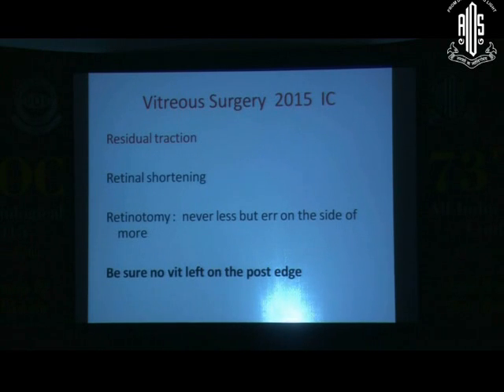However, if there is an intraretinal shortening, it's very difficult to relieve this traction completely. In younger patients with inferior pathology, if breaks are not there inferiorly, we may combine a scleral buckle along with a vitrectomy to help tackle part of the shortening. But if not, then we have to do a retinotomy. And we should remember that it should be generous.